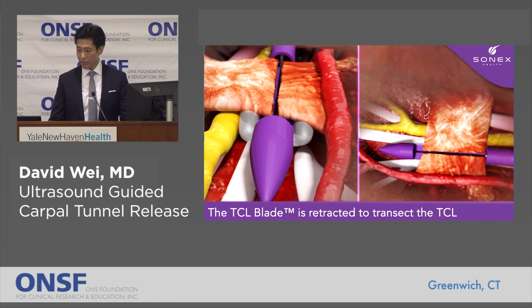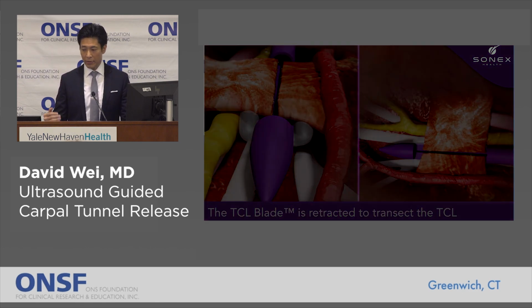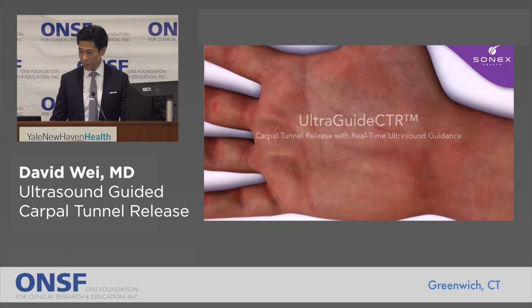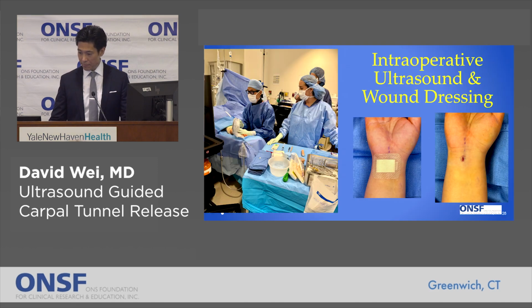So you can only be a candidate for this if you have the safe anatomy or the right anatomy. So I'm not doing this for every patient, but I'll show you the difference here because it has changed some of the results that I've seen. This is an example of our team in the OR. I'm using this device, and this is the wound. It's very small. It's about 2 millimeters.